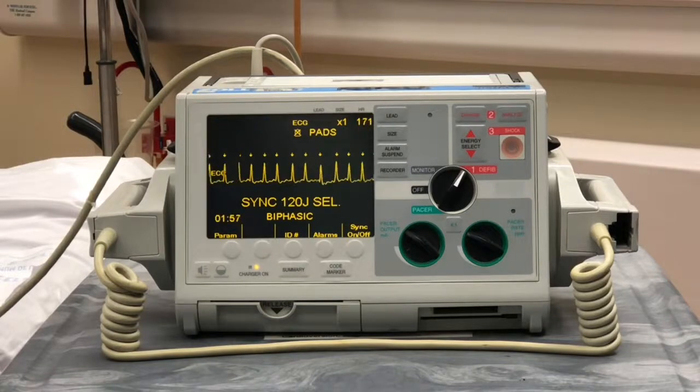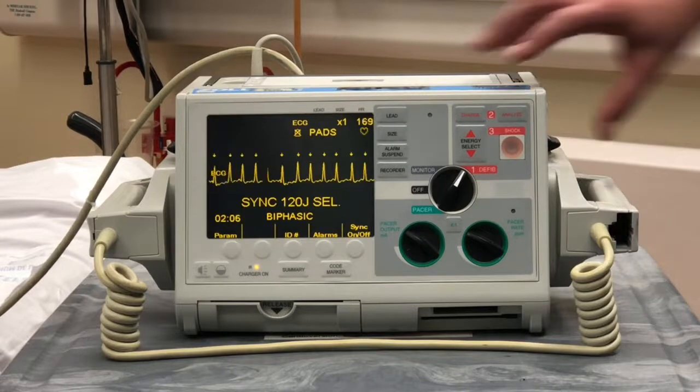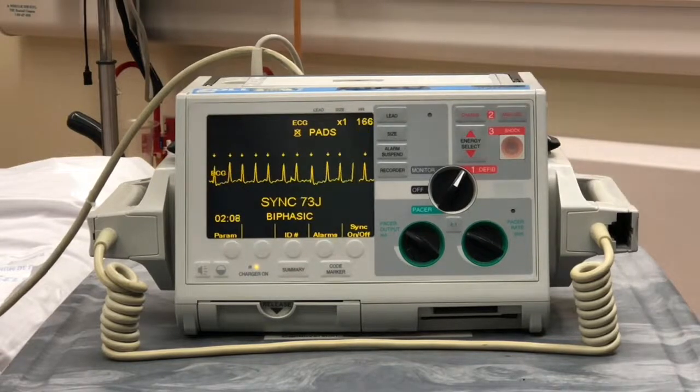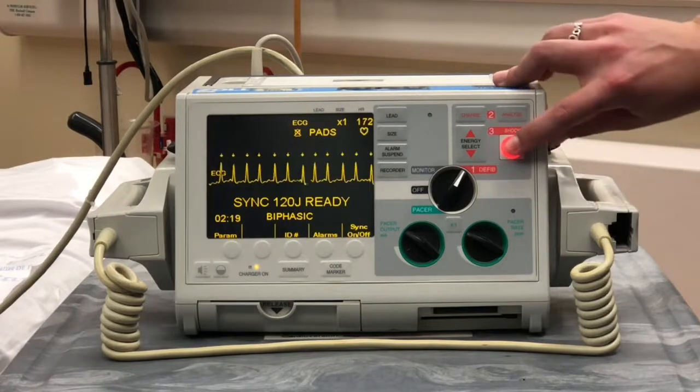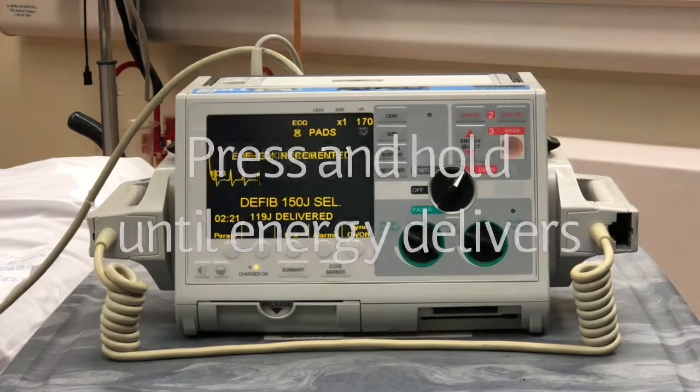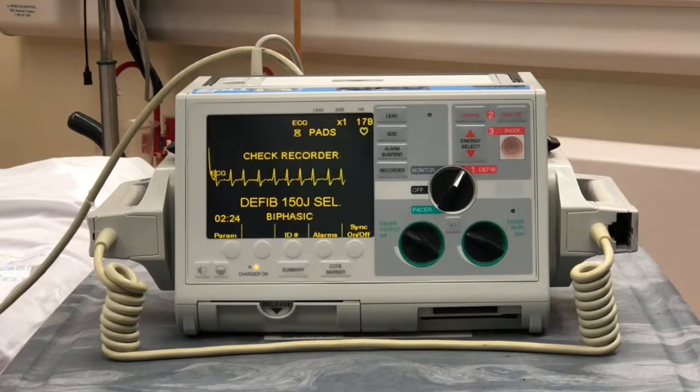We are going to go ahead and arm the defibrillator. So if we could charge the device. And again, the device is ready when the button lights up. And we're going to say, shocking on 3, 1, 2, 3, and we're going to press and hold our button. And the energy is going to deliver at the appropriate part in the cycle. And we will be assessing our patient.